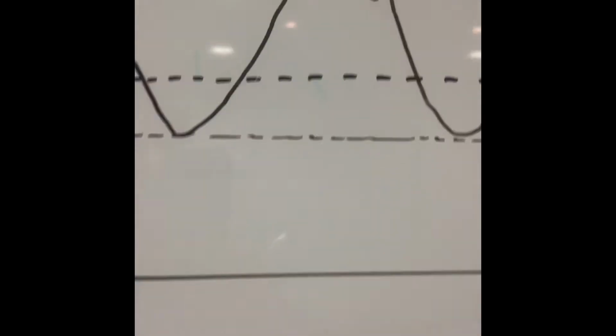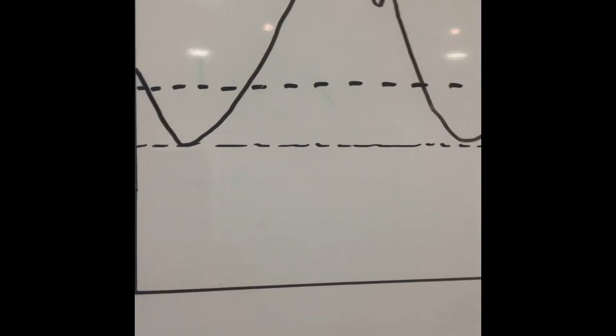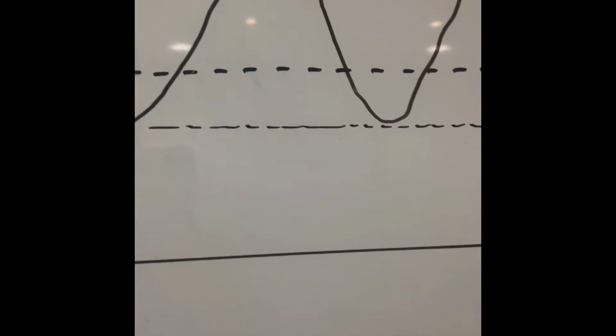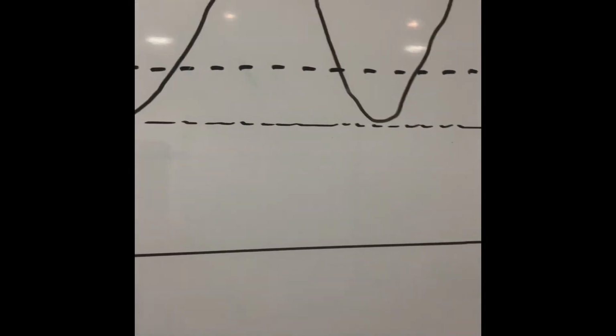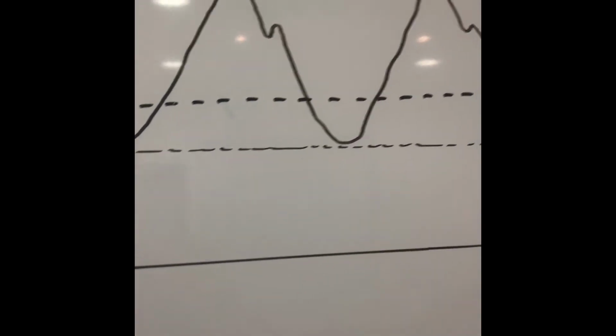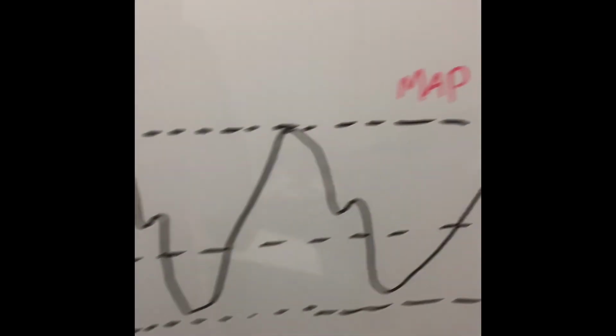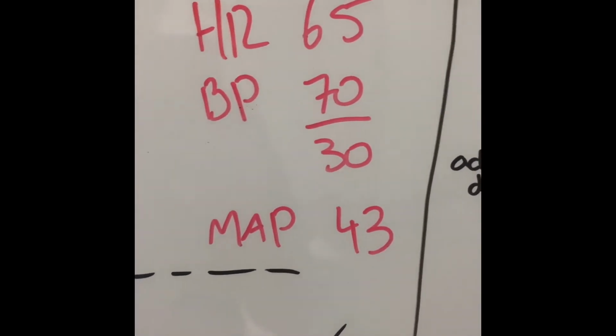So we might be seeing things like this in an AMI where there is a big zone of ischemia, necrosis that is not contracting, or in a patient with a significant history of MIs, they've just got a very scar-tissuey heart. We might be seeing something like this. All right, we'll go down to the next one here. More observations.